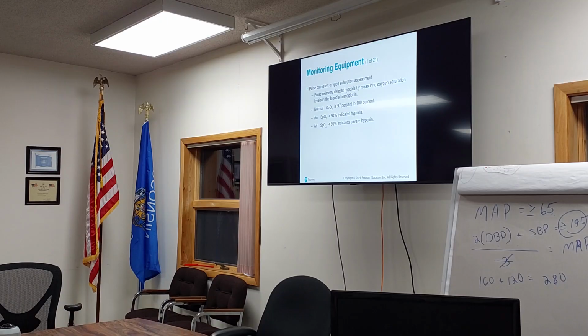And when you put the pulse oximeter on me and read it, it's going to say 100%, because all it's reading is that the red blood cell is saturated 100%, but it doesn't know with what. So it doesn't differentiate carbon monoxide from oxygen. It just identifies saturation. Does that concept make sense?